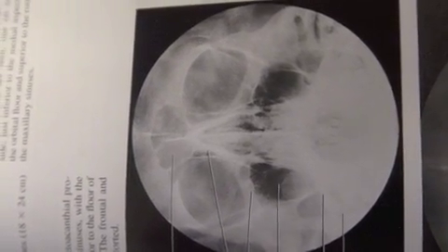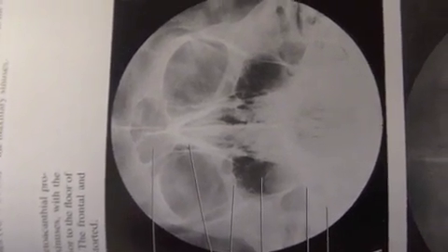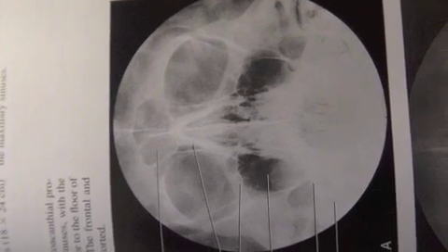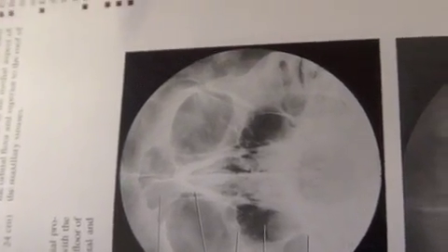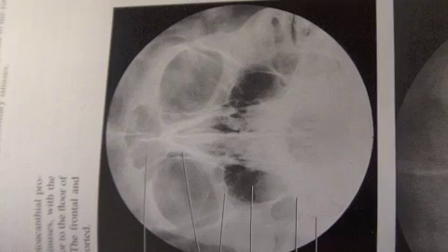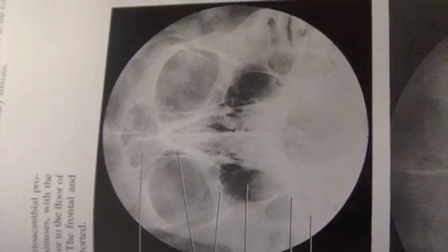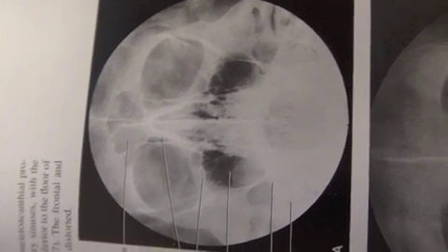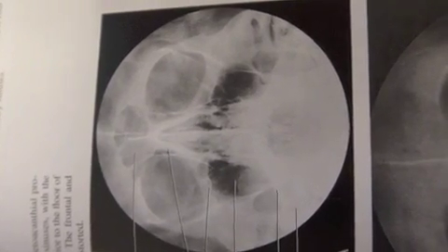Here is the parietoacanthial Waters method for the sinuses. The structures you're looking for are the frontal sinus, the ethmoidal sinus, infraorbital foramen, maxillary sinus, petrous ridge, and the mastoid air cells. And the criteria for this image is to have the petrous pyramids lying immediately inferior to the floor of the maxillary sinuses, equal distance between the lateral border of the skull and the lateral border of the orbit on both sides, showing no rotation, the orbits and maxillary sinuses symmetrical on each side, and you are looking for air fluid levels if present.